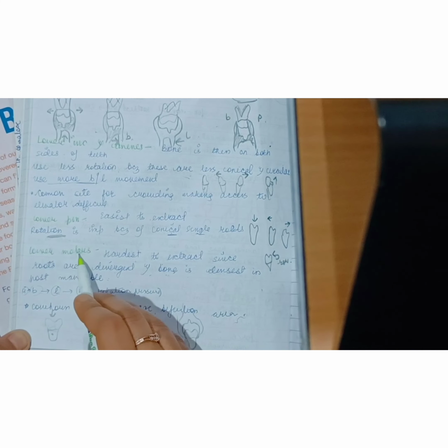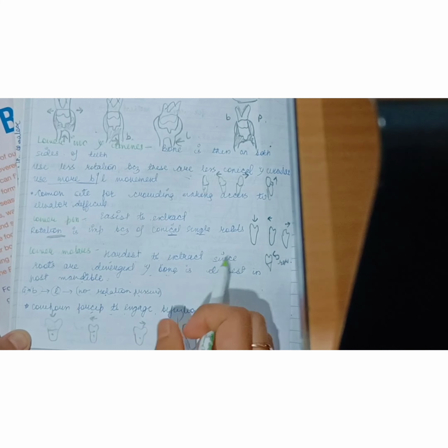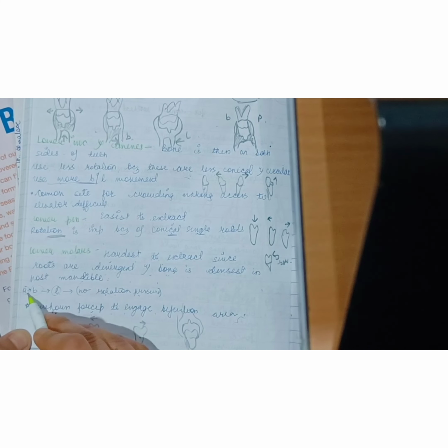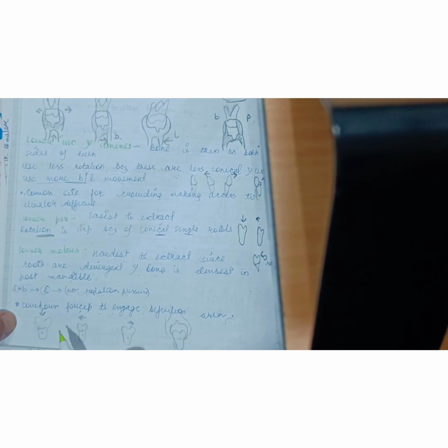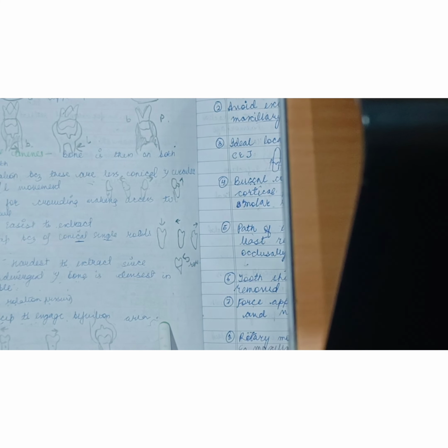Now, lower molars, these are the hardest to extract since the roots are divergent and the density of the bone in the posterior mandible is the greatest. Direction of the force: apical, buccal, and lingual. In case of grossly decayed teeth, cow horn forceps are used, which engage the bifurcation. This was all for the topic Exodontia. Hope you liked it.